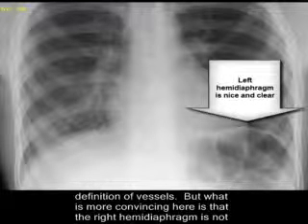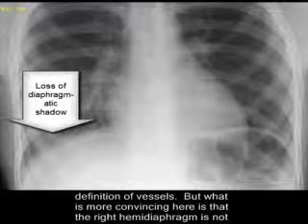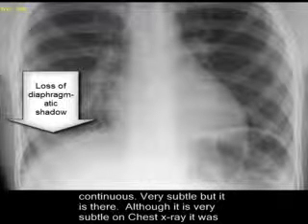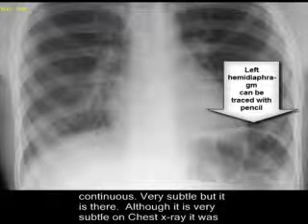But what is more convincing, look at the diaphragm here, left hemidiaphragm and right hemidiaphragm. So there is a discontinuity here in the diaphragmatic shadow. So this area you cannot actually draw the diaphragm with the help of a pencil. Here you can actually draw the diaphragm with the help of a pencil clearly.